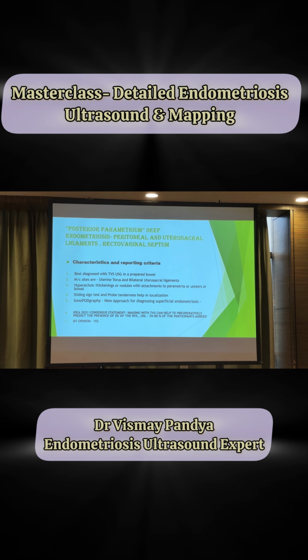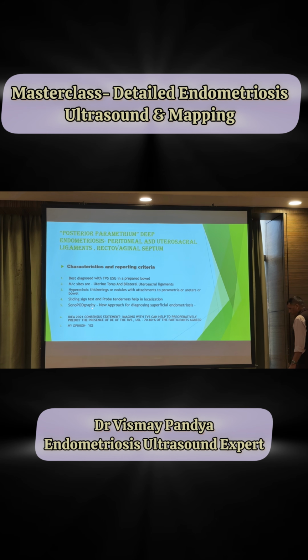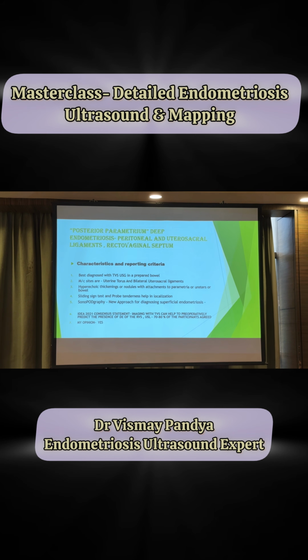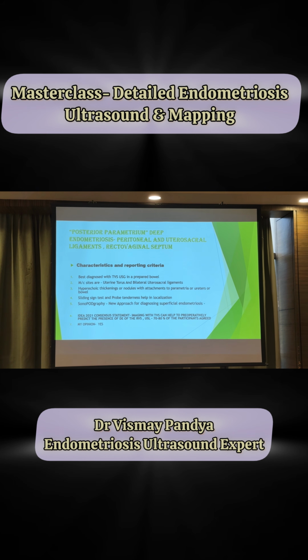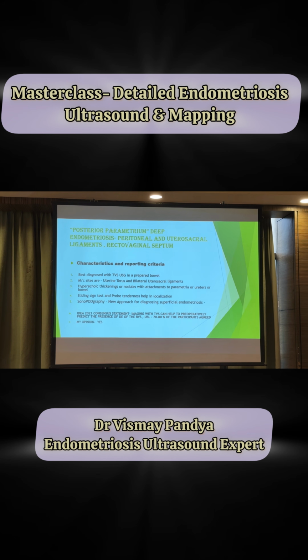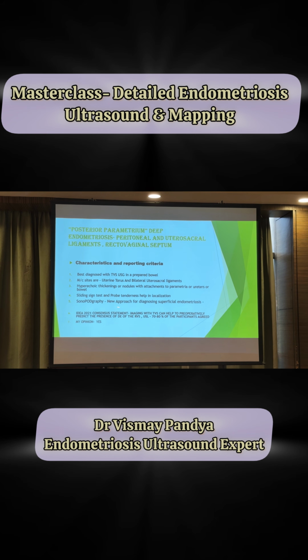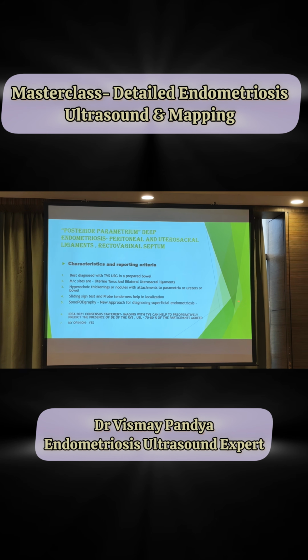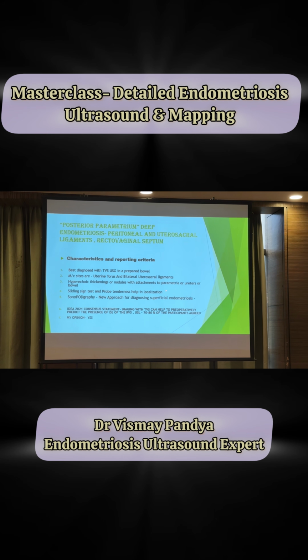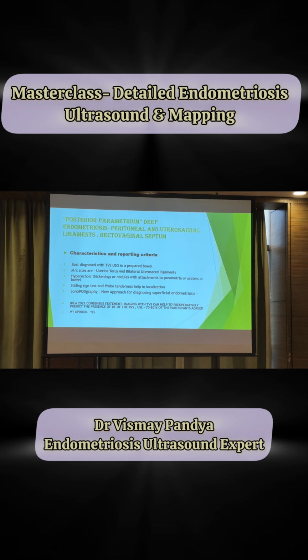So what is sonopodography? We all do SSG for our fallopian tube patency test. Now, it has been recently very popularized by one Dr. Mehta, who is a very big name in Hyderabad, and she does it routinely. I also started doing it. And of course, there's Matthew Leonardi. He's also a very good gynecologist and surgeon himself.